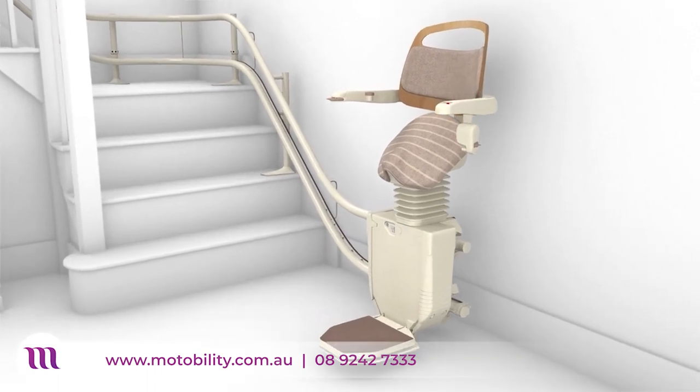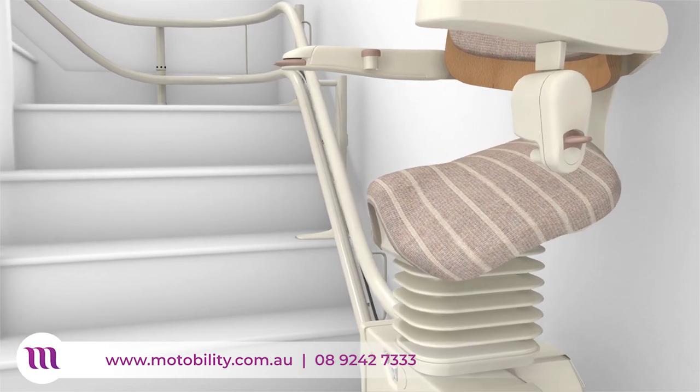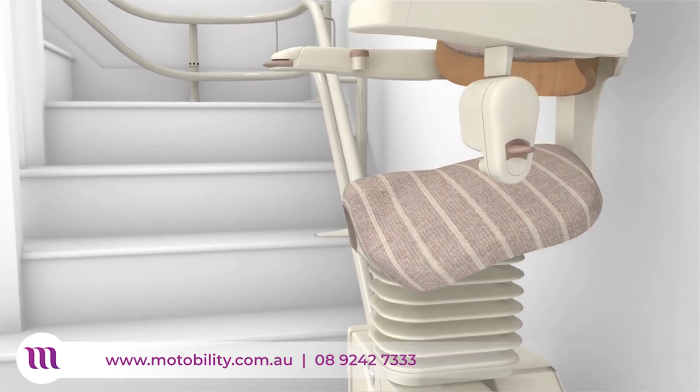The Sadler's innovative saddle-style seat lowers and raises with the user and, together with its elevated position, makes entry and exit easier and more convenient.